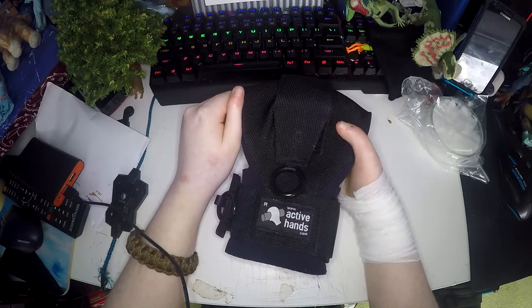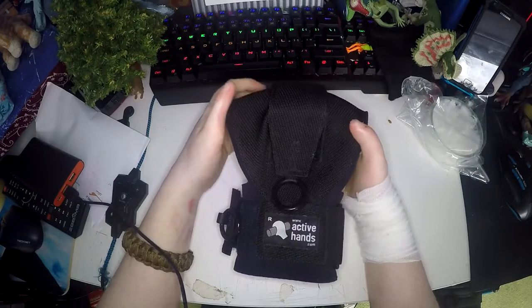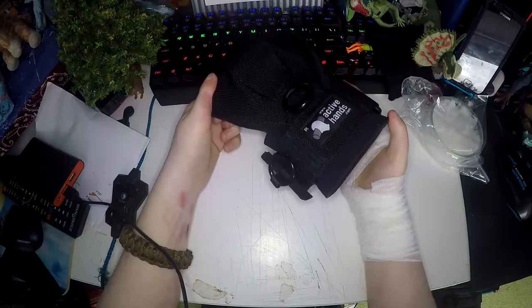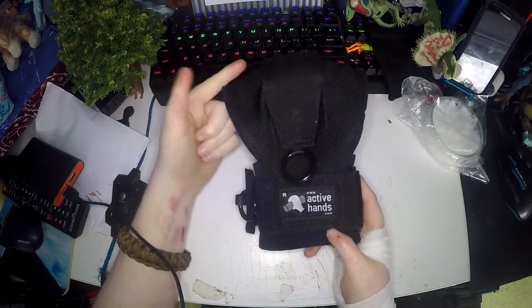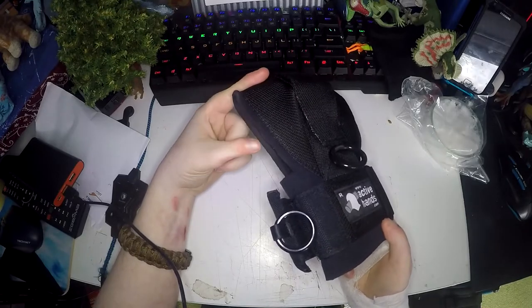This really is a necessity if you have problems with your hands. I really love this product and it is definitely worth buying. Even though this was 40 pounds, I think it is well worth it.